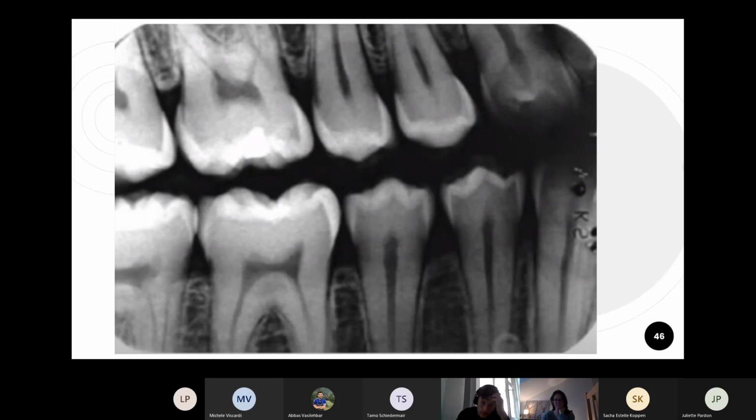Yeah, okay. So again, I think there's only one caries lesion, at least one good visible one, which is on 1.6 mesally. You can see the radiolucency even in the dentin. And what else to say is you can see really nicely the bone here. You can see that there is some bone resorption. It's not much.